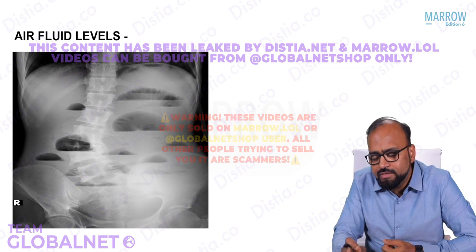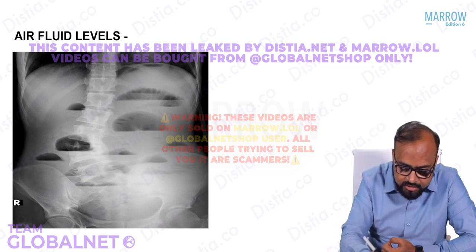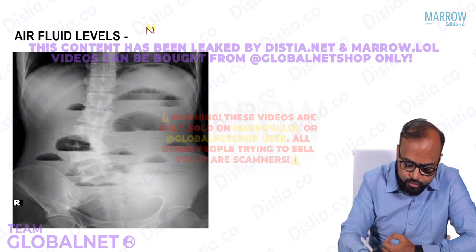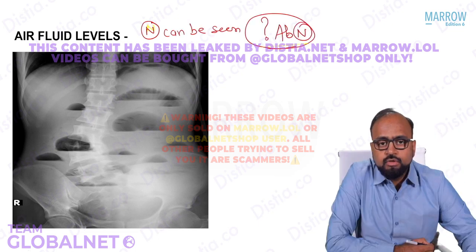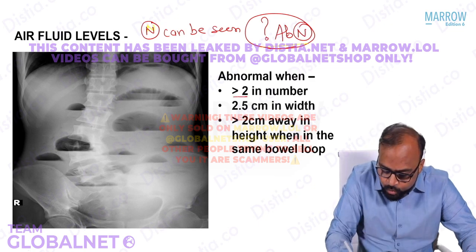Now, are air fluid levels always abnormal? The answer is no. In some cases, normally also air fluid levels can be seen. Air fluid levels are abnormal if they are more than 2 in number.